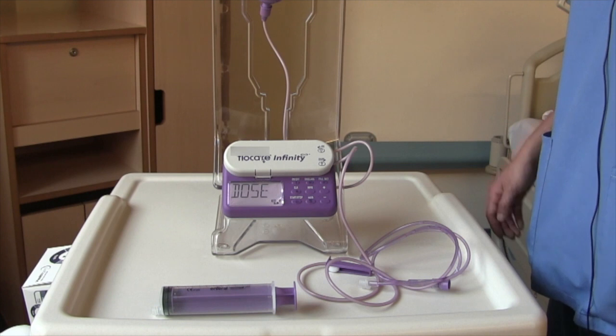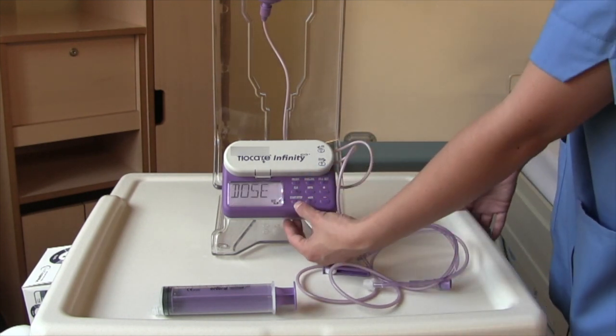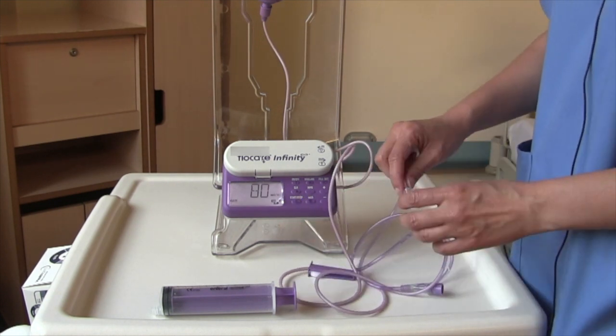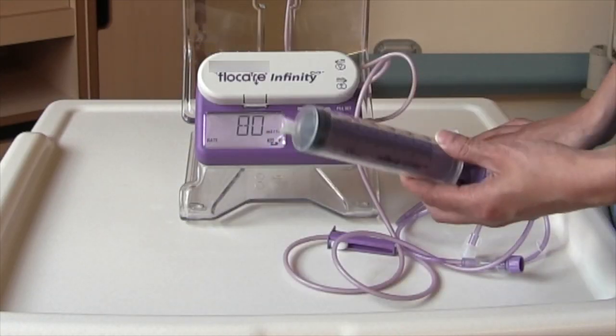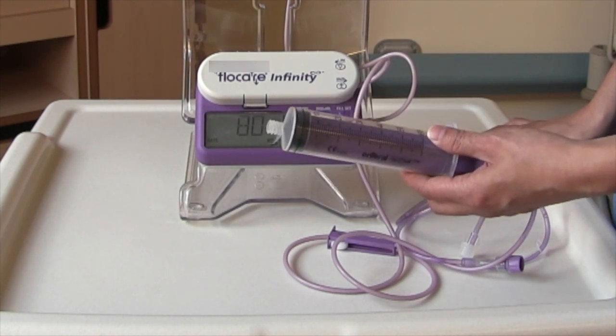Once your feed is done, it will say end dose on the screen. To stop the alarm, press the start-stop button, and now you'll proceed to disconnect the feeding set from your feeding tube, and remember to flush with water. It is important to flush after your feed to prevent blocking of your tube.